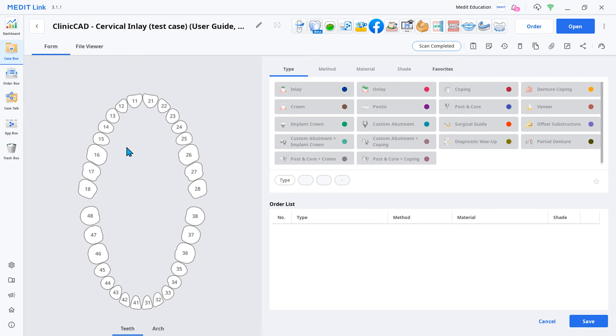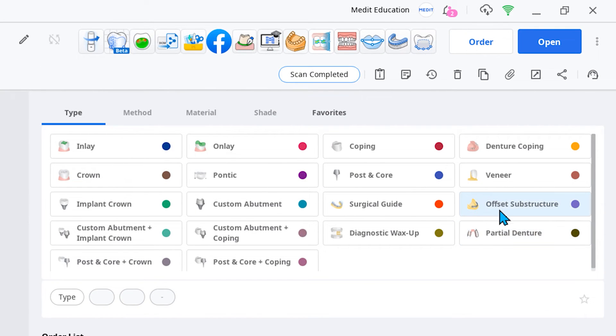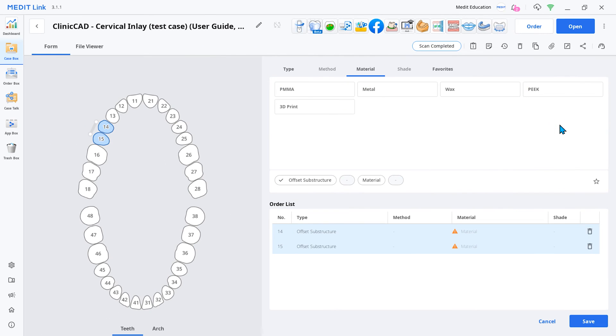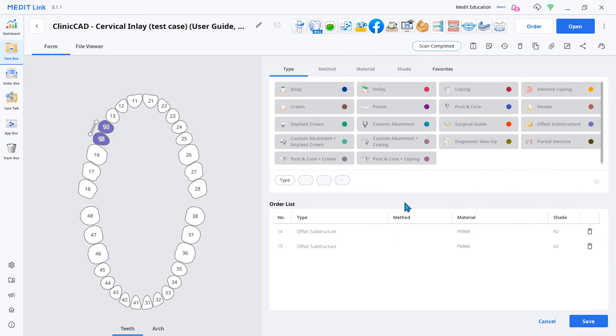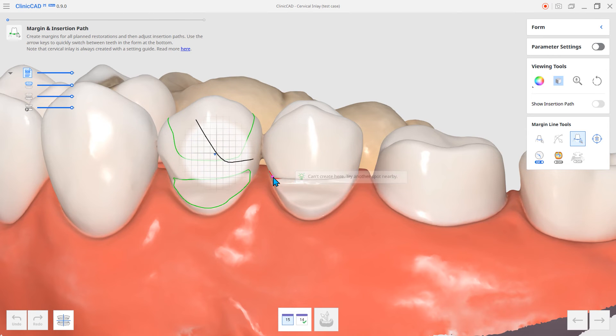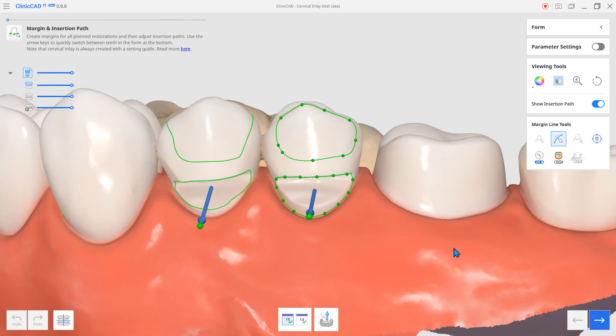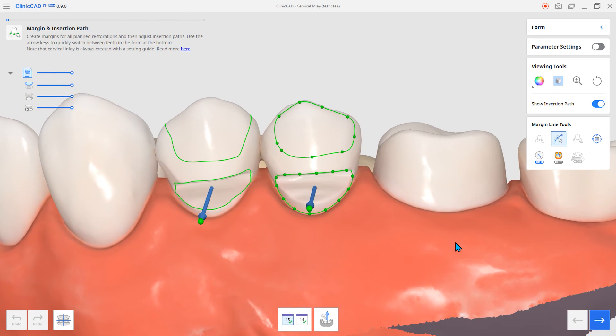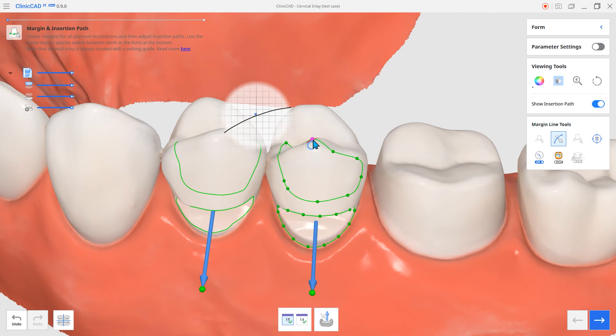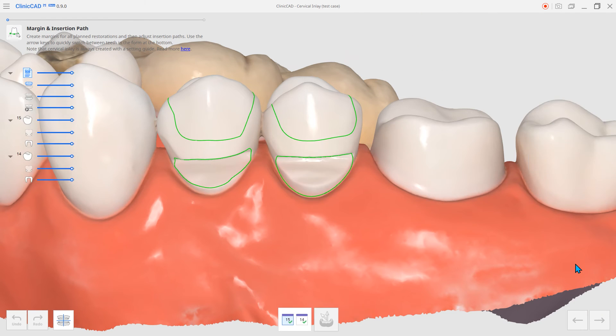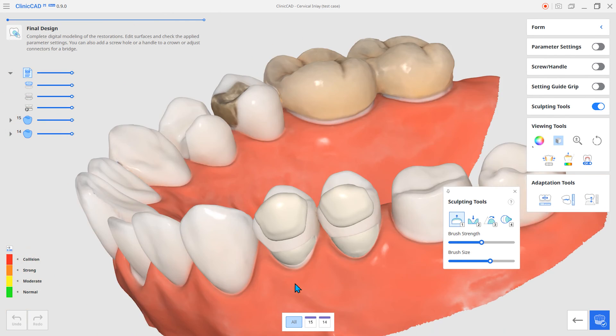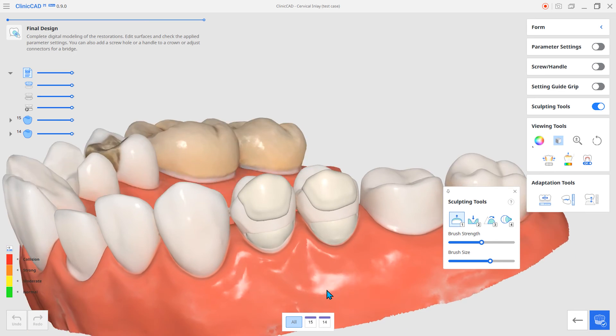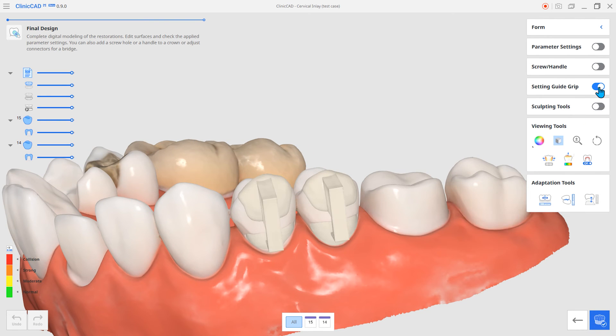To fabricate the cervical inlay, go to the form information and set the restoration type as offset substructure in Medit link. Creating a margin over the cervical abrasion will create the second margin for the guide grip. Adding a guide grip completes the cervical inlay.